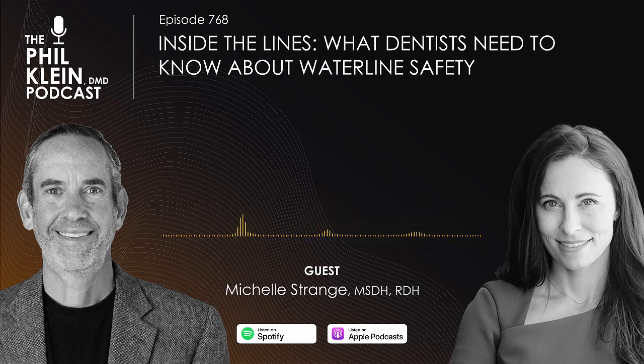Yeah. The only time where I am still using tablets is on my mobile equipment, because I will break a straw off or cartridge off if I pack it up incorrectly. So I still use tablets in that space, but on these stationary units, it's a no-brainer to me. But you have to add water to the water bottle all the time, right? Because it only holds so much. Yeah, and you just constantly refill.